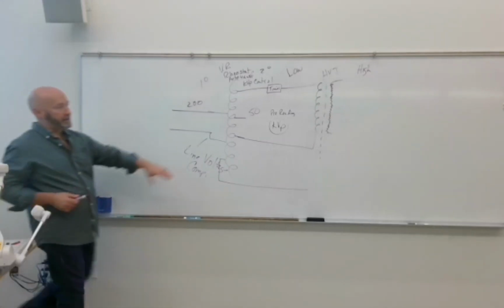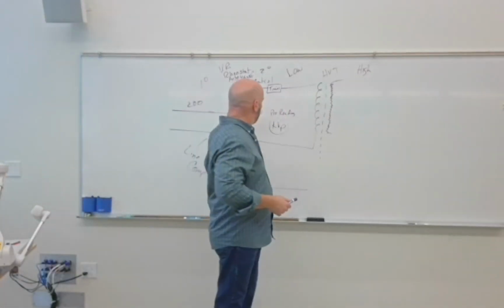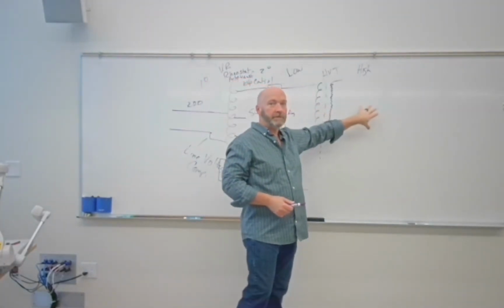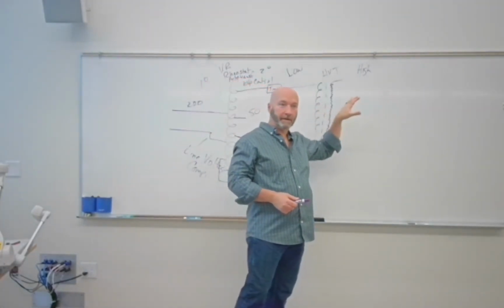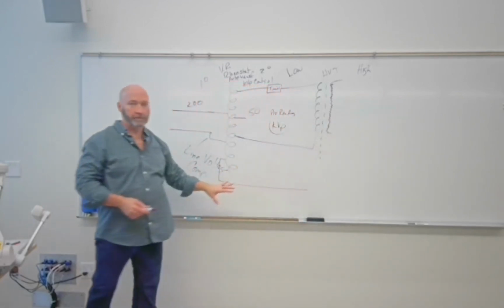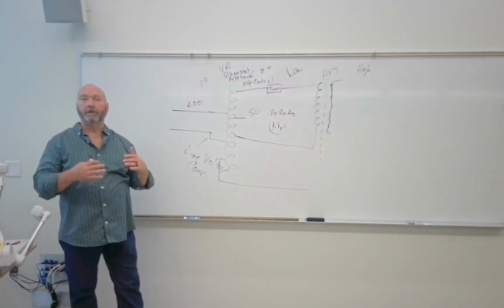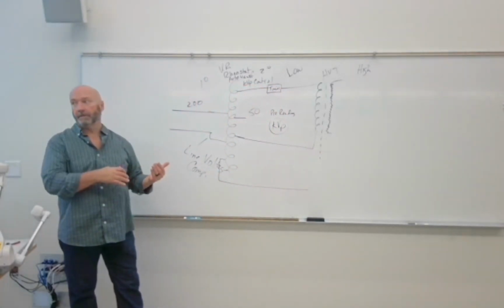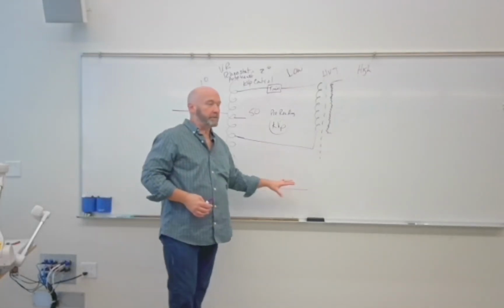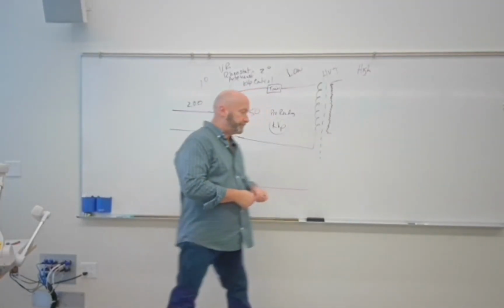Because this is low voltage at 200, in our example here, 200 volts. This is high voltage in tens of thousands, maybe over 100,000 volts. This is going to be very low voltage at 25 volts. So I'm going to call it the filament circuit, because no part of this is going to be high voltage until it gets to the filament itself.